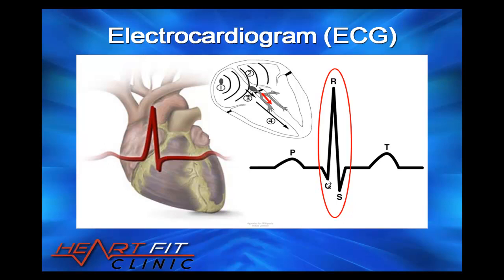So it comes all the way down the septum and out to the side. Now, it does not always look like this, but it will always be a big spike in the ECG. This big spike is the ventricles contracting. Now, the last blip on the ECG is the T wave. And because the ventricles are such large chambers of the heart, when the ventricles relax, it denotes this with a T wave. Now, people sometimes ask, why doesn't the atria send off an electrical signal when they relax? And my answer to this is they are not big chambers like the ventricles, and that's why they relax really inside the QRS complex.